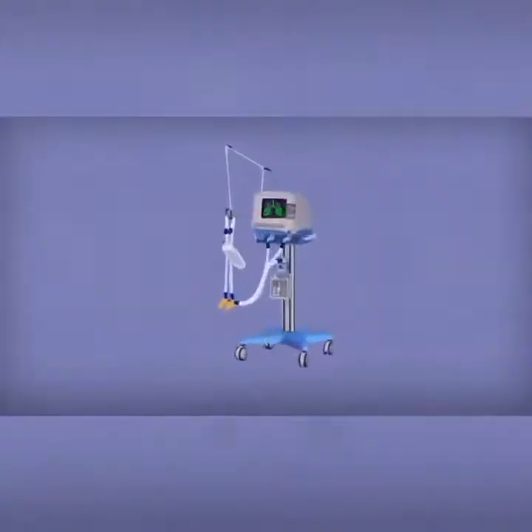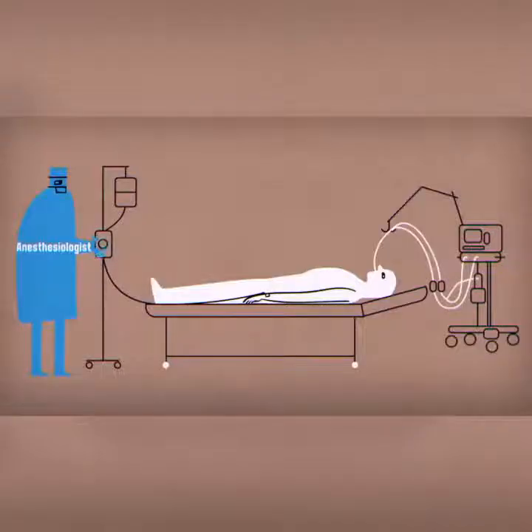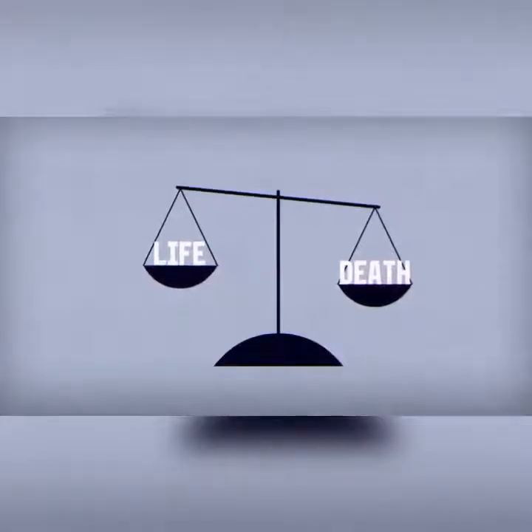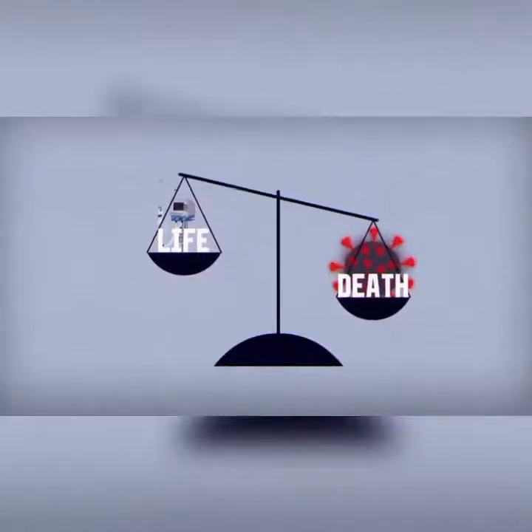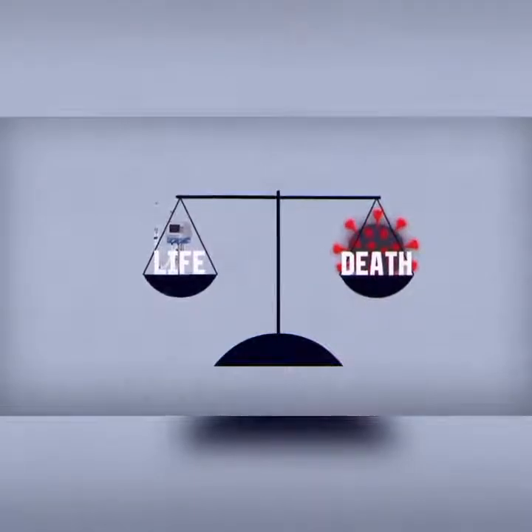These machines aren't used as a standard treatment, but rather as a last resort. Enduring this influx of pressurized air requires heavy sedation, and repeated ventilation can cause long-term lung damage. But in extreme situations, ventilators can be the difference between life and death. And events like the COVID-19 pandemic have shown that they're even more essential than we thought.